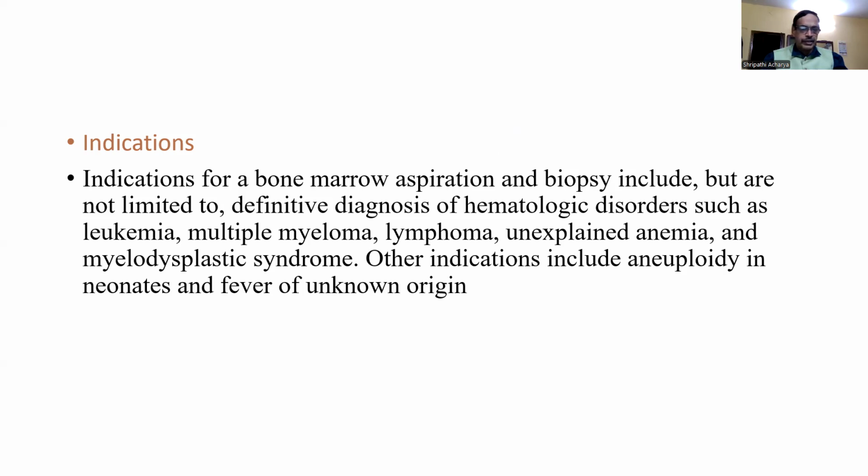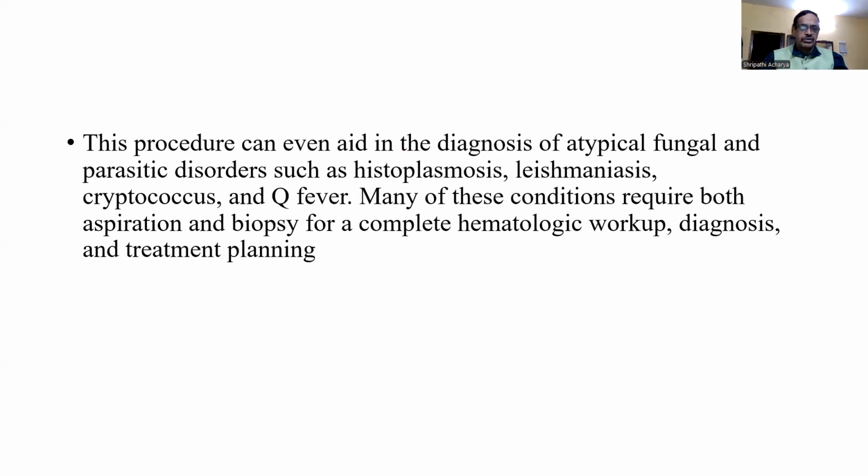aneuploidy in neonates and fever of unknown origin. This procedure can even aid the diagnosis of atypical fungal and parasitic disorders such as histoplasmosis, leishmaniasis, cryptococcus, and Q fever. Many of these conditions require both aspiration and biopsy for a complete hematologic workup, diagnosis, and treatment planning.